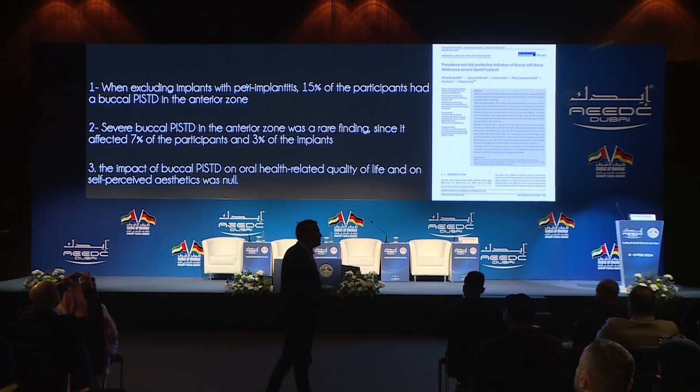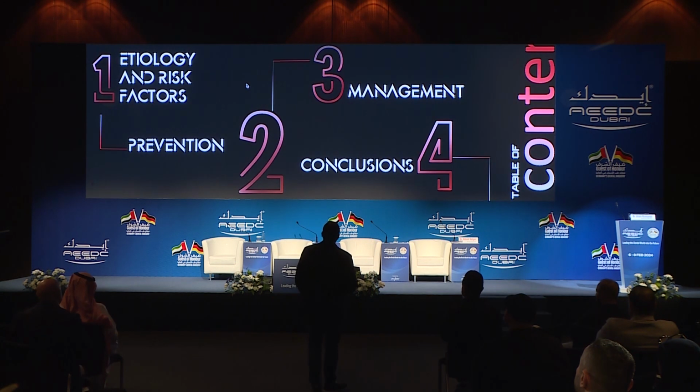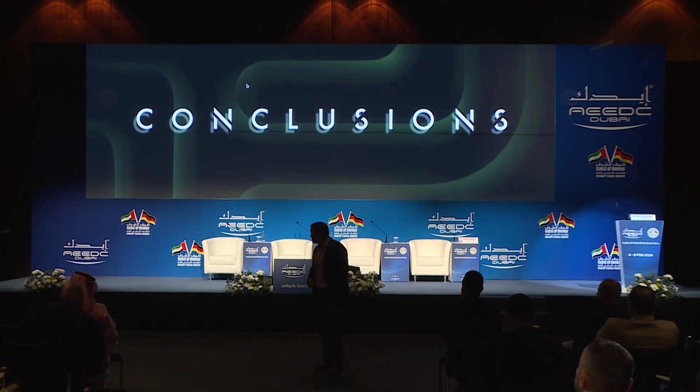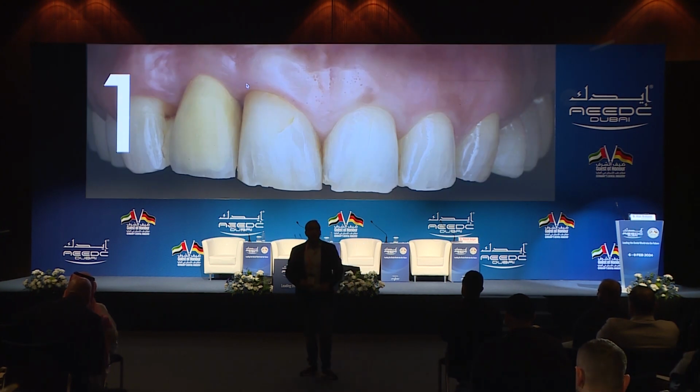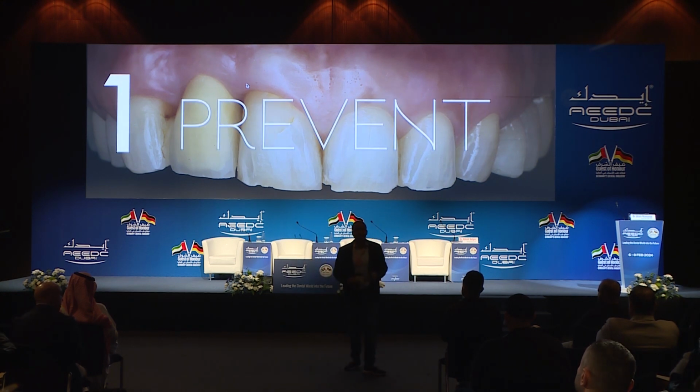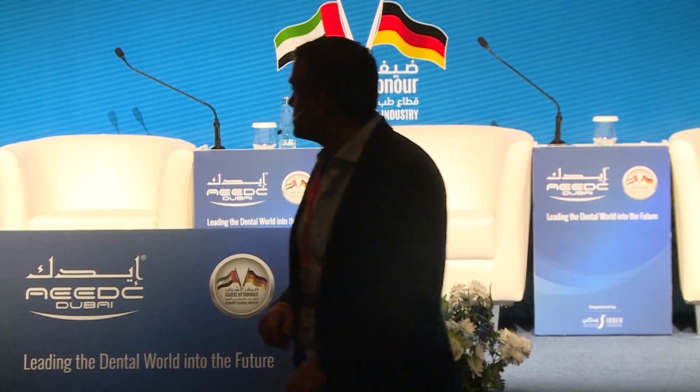And we could have avoided this by placing the implant in an ideal position. To come to the conclusions of this chapter, always when it comes to complications, the best thing to do is prevention. If you can prevent it, this would be your best bet. This is the most predictable treatment when you prevent complications.